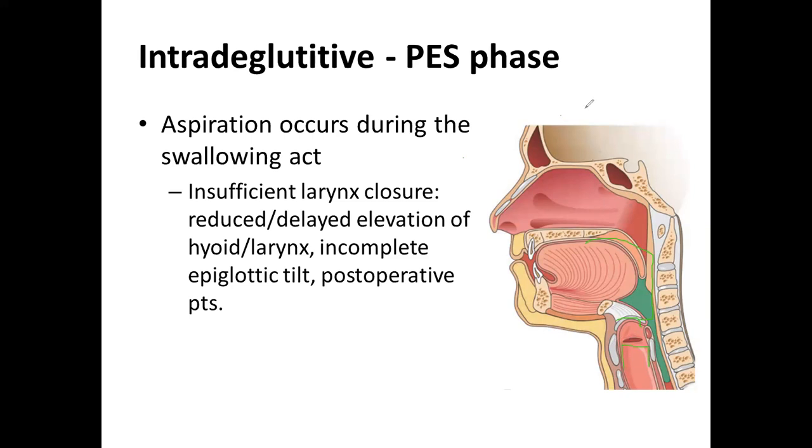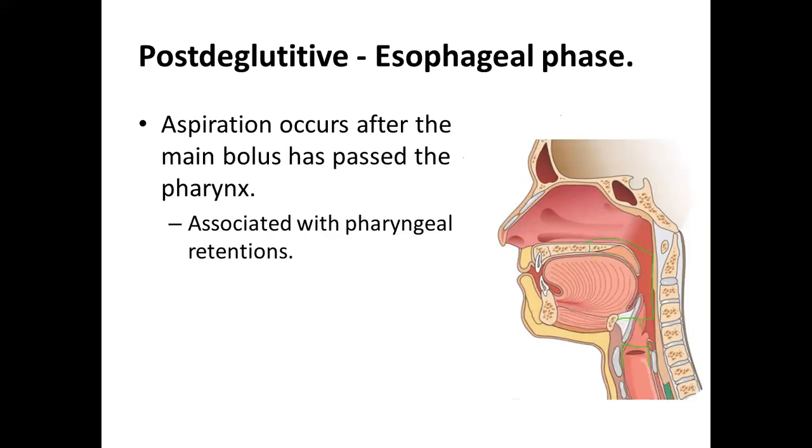The other phase is post-deglutitive, where we have contrast media going down the esophagus.